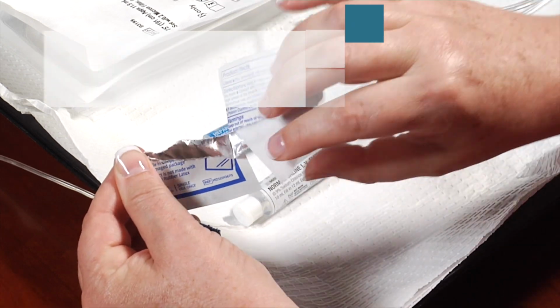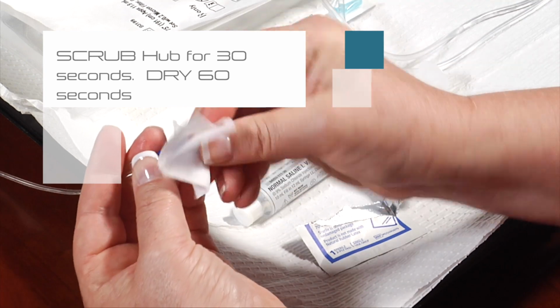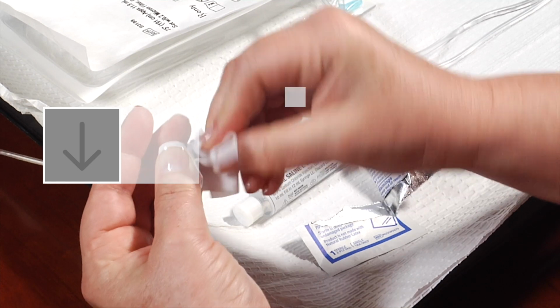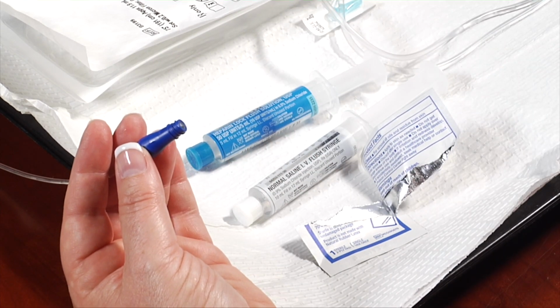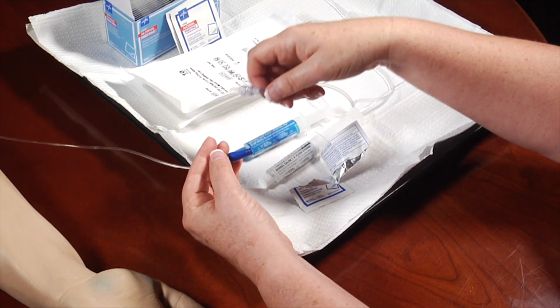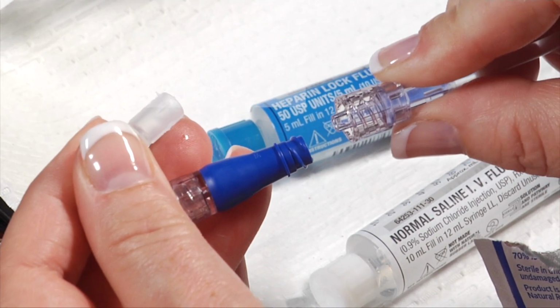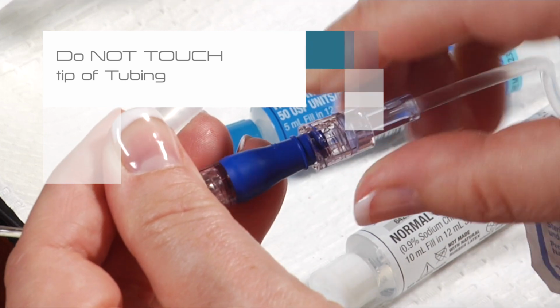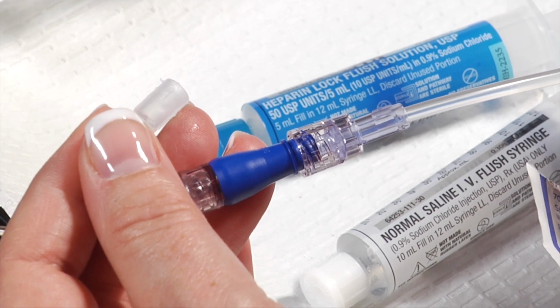Scrub the hub of your injection cap vigorously for 30 seconds with an antiseptic wipe, and allow to dry for 60 seconds. Remove the end cap from the gravity tubing and attach it to the injection cap of your IV catheter by pushing and turning clockwise to secure in place. Do not touch the tip of the tubing.